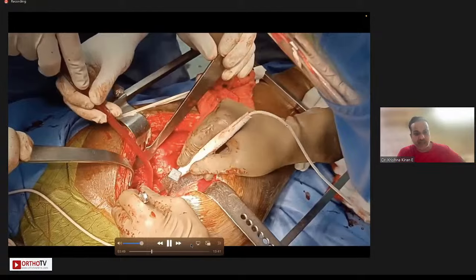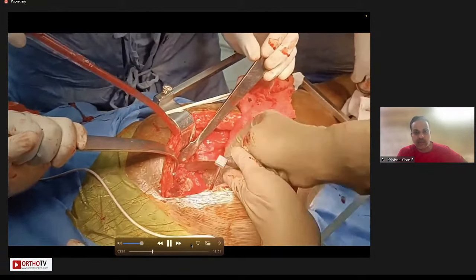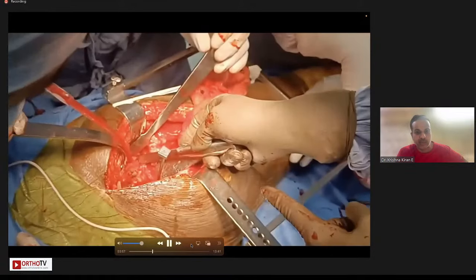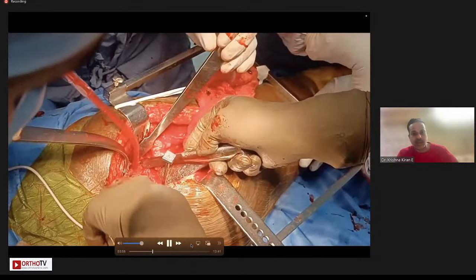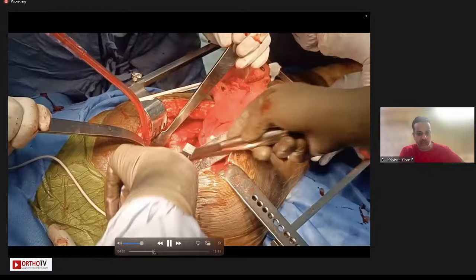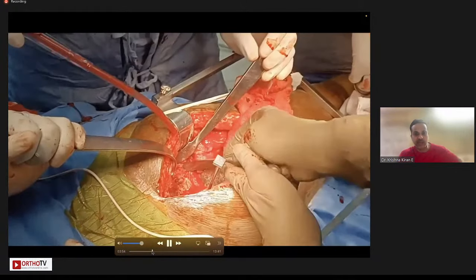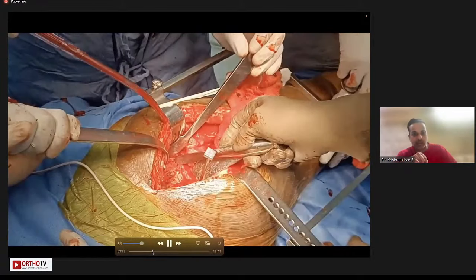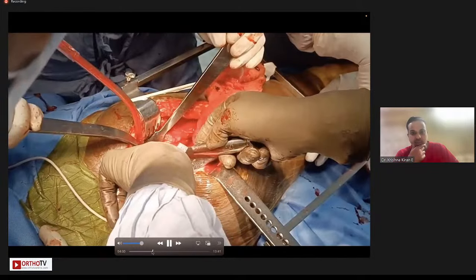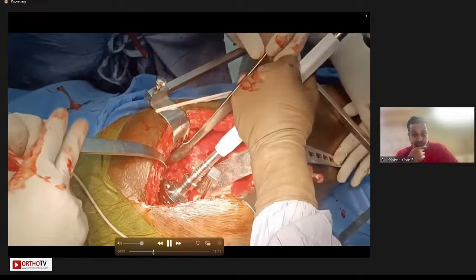And these instruments have been designed by Dr. Vijay Bose. And this I find very useful, the Bose concept hip set, which has helped us. And that's the location of the superior pubic ramus. I'm pointing out at a 4 o'clock position with the osteotome. So I'll just go back to that for the people. It is important in these situations with poor acetabular bone quality to put screws into the superior pubic ramus.